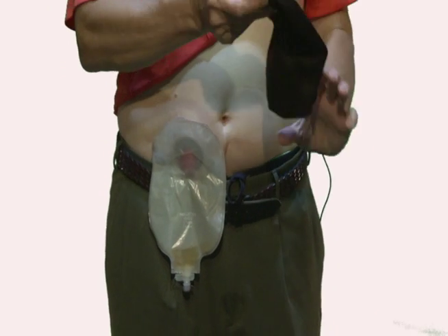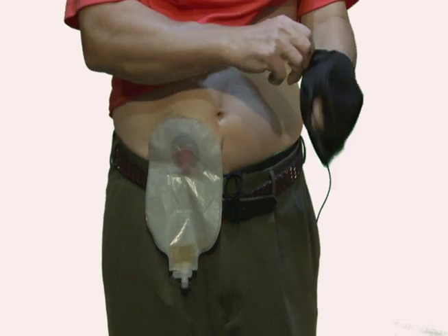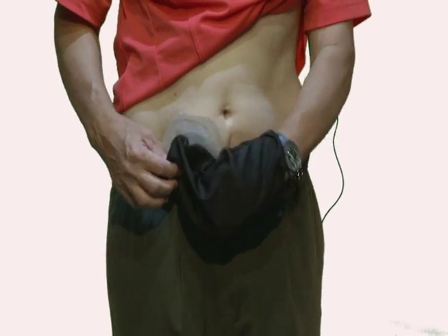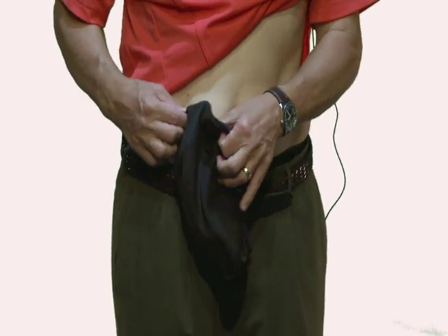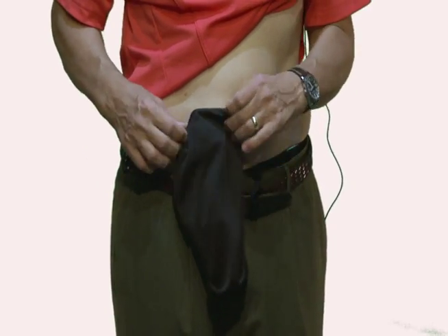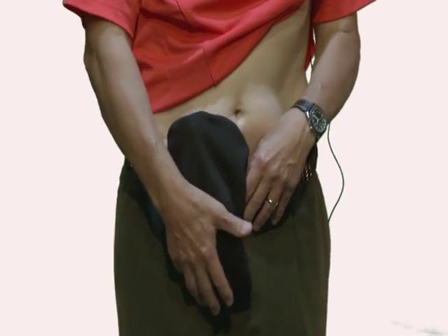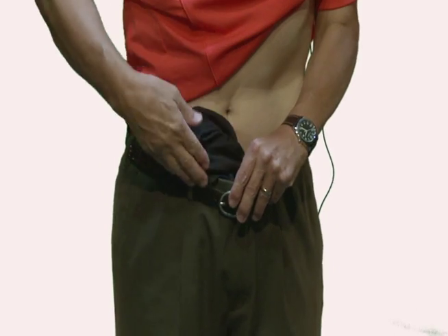It is easy to apply. To apply the Stoma Cloak, push your hand through the wide end, grasp your appliance, pull the appliance down gently into the Stoma Cloak, reposition the elastic closure around the base of your appliance, close the envelope at the bottom, and tuck it.